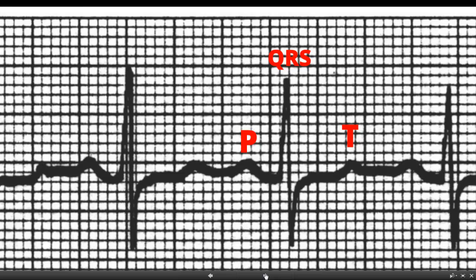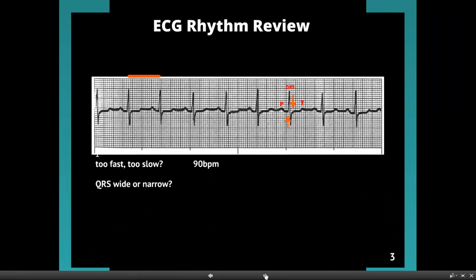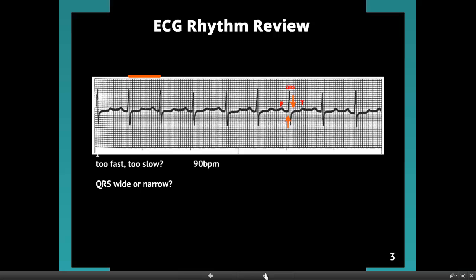Let's take a look at where the QRS starts — I'm going to put it down right on the line right there — and where does it end? It's where the S-wave, the bottom spike, comes back to baseline. I'm going to put it down right about here, and we can count in between: one, two, and a half. That puts us under three boxes, so we are narrow. That means the signal from the AV node was transferred through the Purkinje system. So QRS, we'll put this down as narrow.